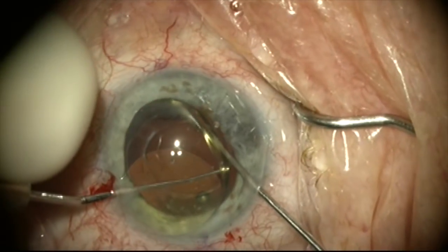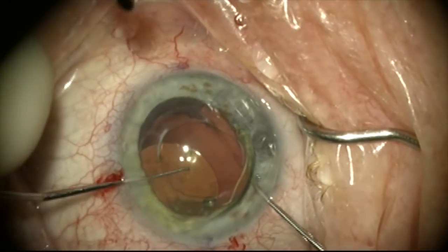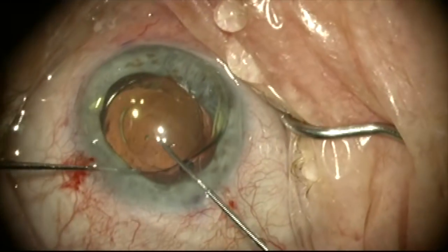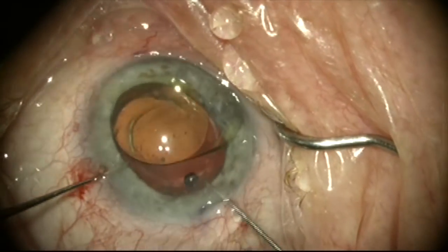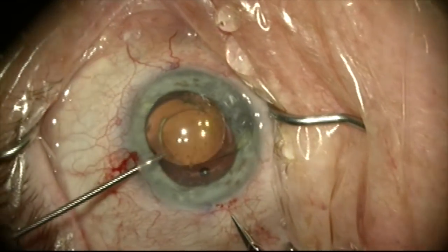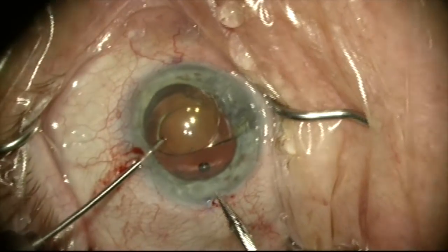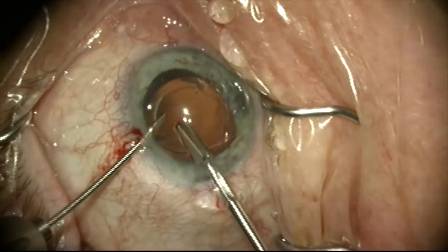This haptic is free now and we can start to take this lens out. We're going to center the lens in the anterior chamber and be careful not to let that sharp cut end of the other haptic damage anything. I'm going to grab the optic with a 23 gauge MST micro holding forceps and hold the optic while I cut the lens with a 19 gauge Packer Chang scissor.